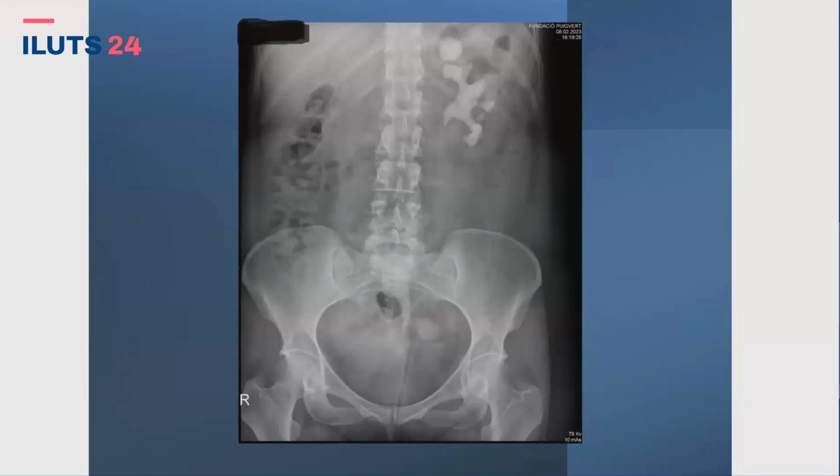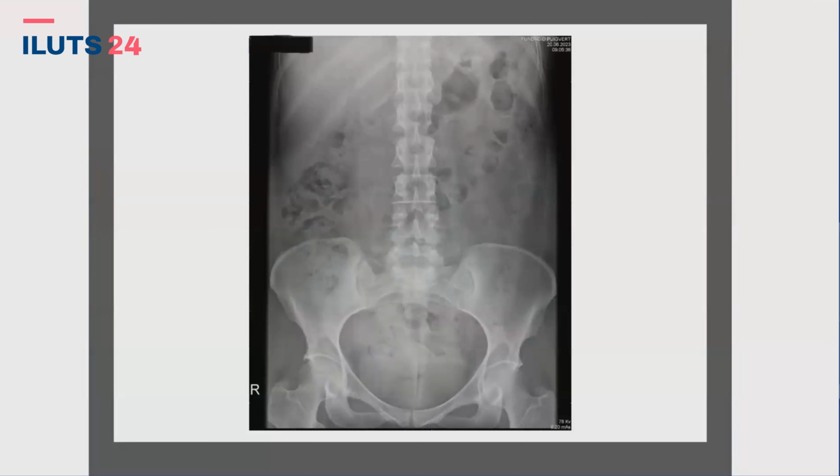So I did that. I was inside the diverticulum, and I noticed that I had punctured the pleura, so I stopped the surgery. And later on, I have done a supine PCNL in two surgeries, but in the second surgery, with the second track on the middle calyx, I moved the kidney down, and then I was able to do the puncture direct to the diverticulum.